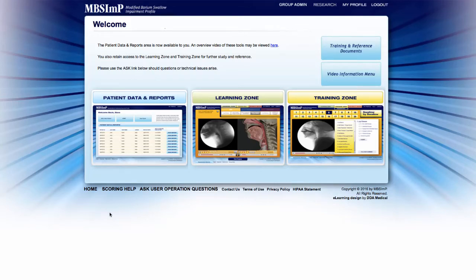The MBS IMP website includes an Express Report feature that allows clinicians to quickly enter MBS IMP scores into the database and produce an abbreviated report.